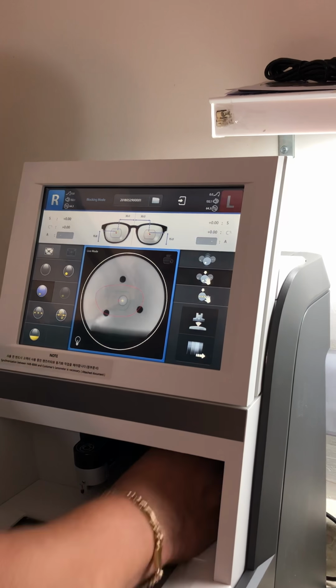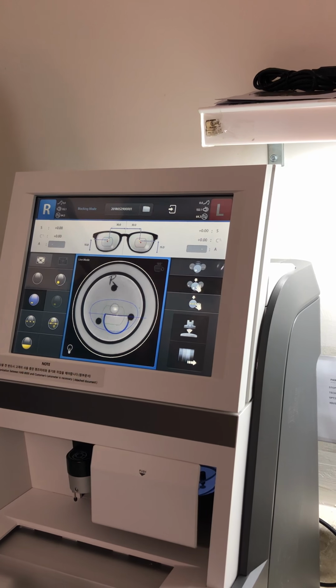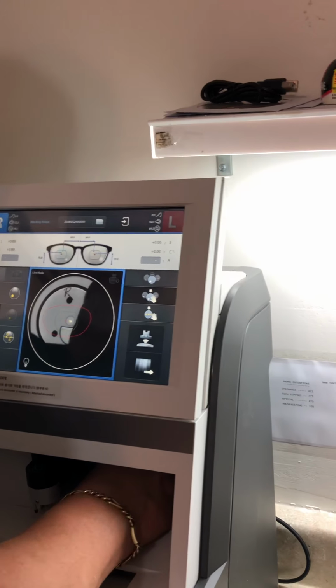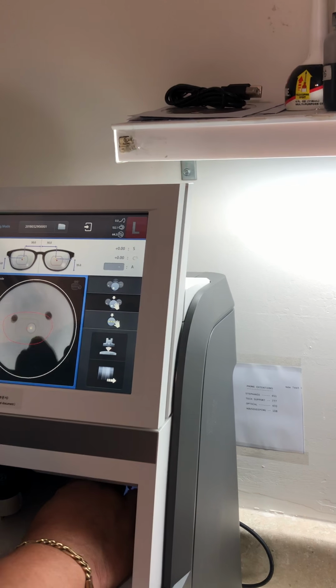Because all I have to do is insert him in here, and it finds the top part of the seg. Oh yeah? What do you mean? Why did we select this, right? You want automatic. Yeah, automatic. That's cool, right? It is very cool.